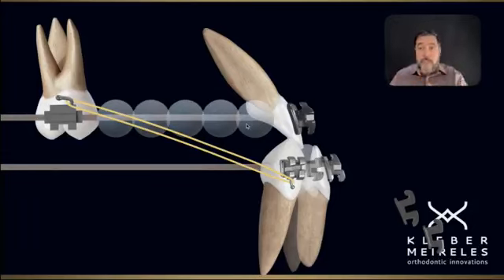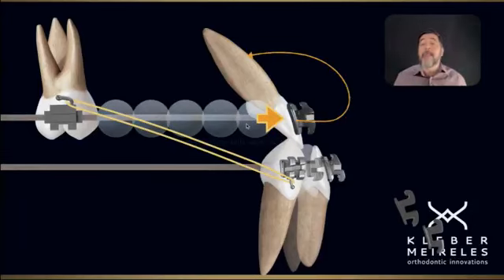So the contact points will reach the anterior segment, and then will incline anterior segment buccally. So we already have a good inclination, a steep inclination of upper teeth. The upper teeth, they are proclined to compensate this, and we are going to propose more inclination, which is very bad in some cases because we're ending up with a very strange, very odd anterior teeth inclination.